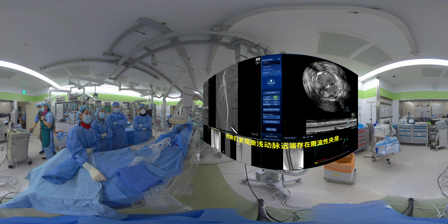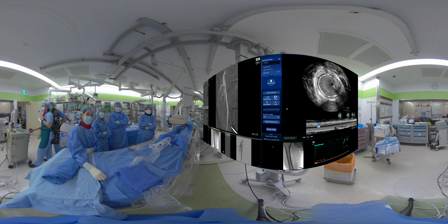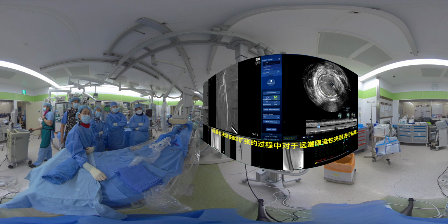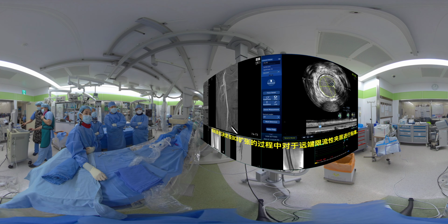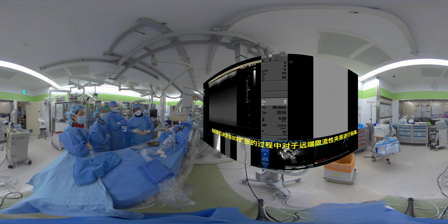But we found that a residual distal SFA dissection was left with flow limitation. So we decided to balloon the residual dissection area again during DCB inflations.